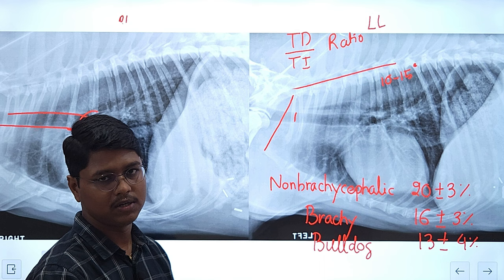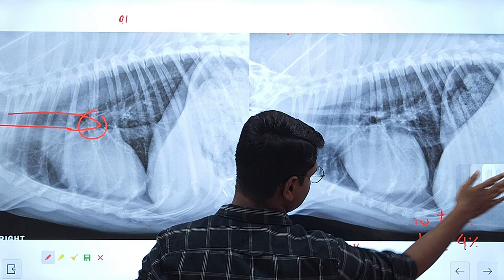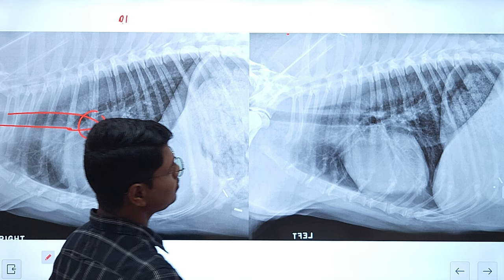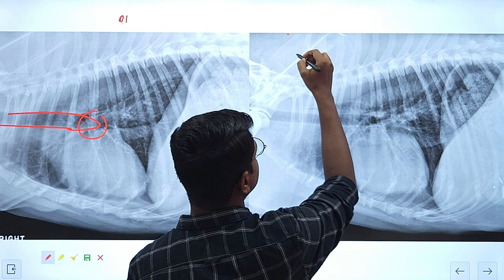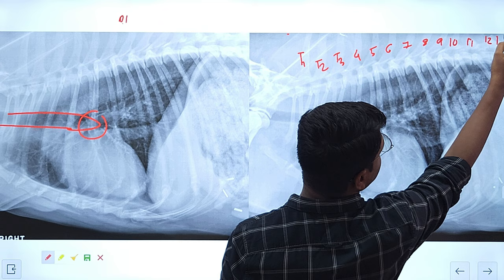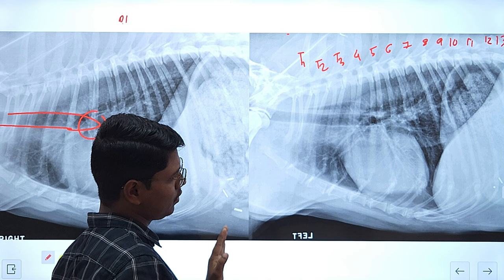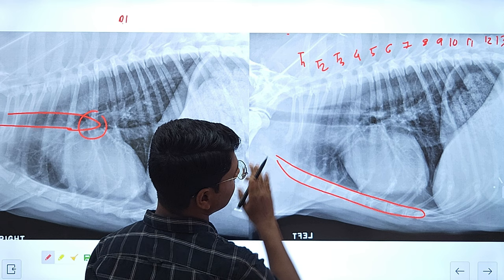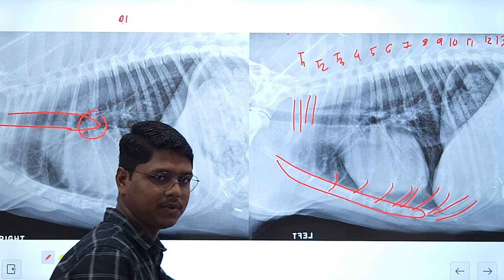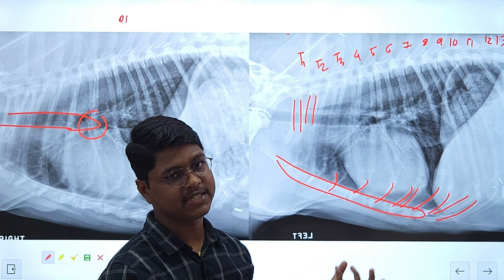Next we will go for the thoracic wall. In lateral radiographs, you can evaluate the thoracic spine — T1 through T13. You can also evaluate the sternum and the ribs. Here you can see the cartilages. In young animals, you may find mineralization of these cartilages. In older animals, mineralization of the cartilage is a consistent and normal finding. The first few ribs are basically perpendicular to the spine; after that, they deviate caudo-ventrally.